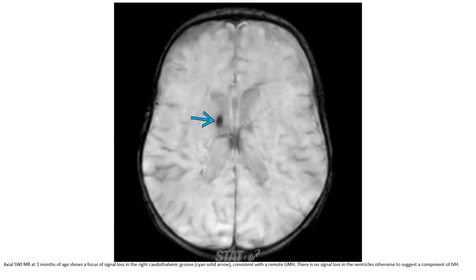This is the SWI MRI at three months of age, showing a focus of signal loss in the right caudothalamic groove, consistent with remote germinal matrix hemorrhage. There is no signal loss in the ventricle to suggest an associated component of intraventricular hemorrhage.